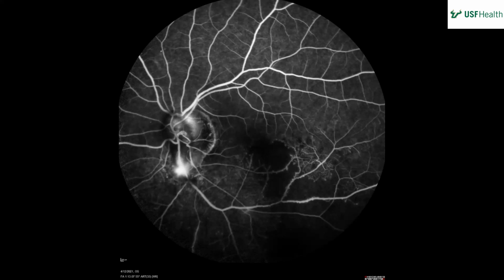Can you draw, Grant? Can you point where the foveolar avascular zone probably should be? You sort of look at the truncation, right? Go down, left, down a little, left a little, right? Probably right around there. You see that vessel kind of ends, probably a little more to the right, down a little, right there, maybe a little left. Yeah, right there. That's probably where it should be, because you can see the vessels are sort of pointing that way. So I think that is getting clipped by the non-perfusion.